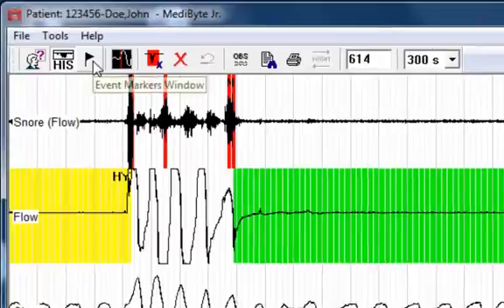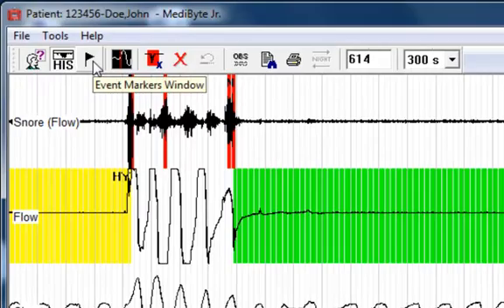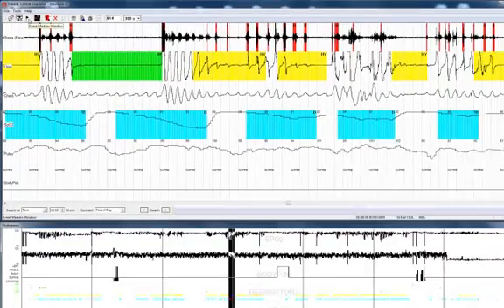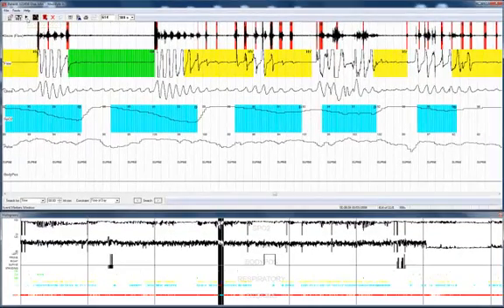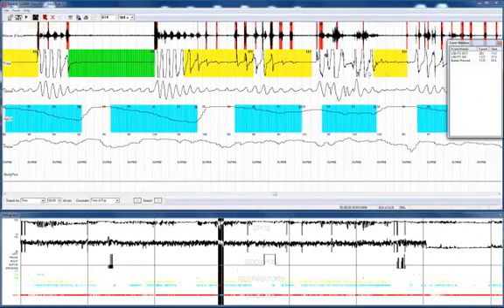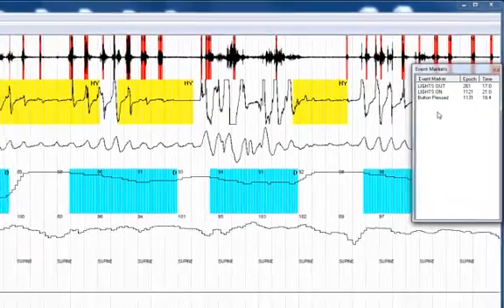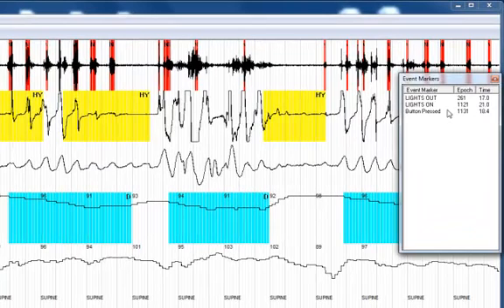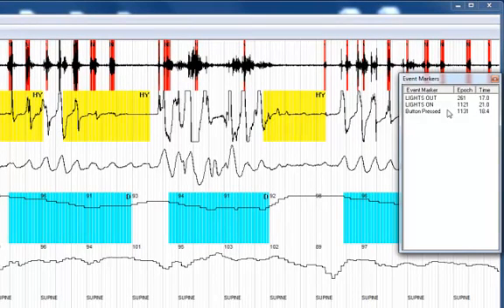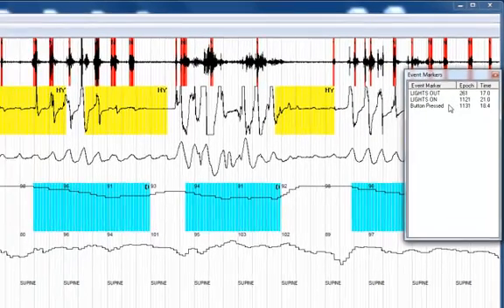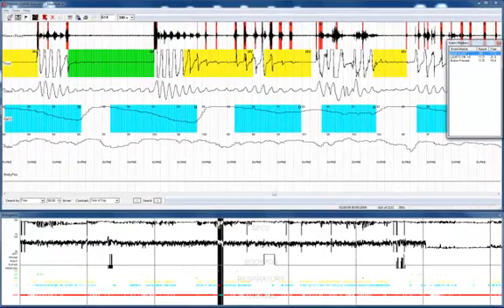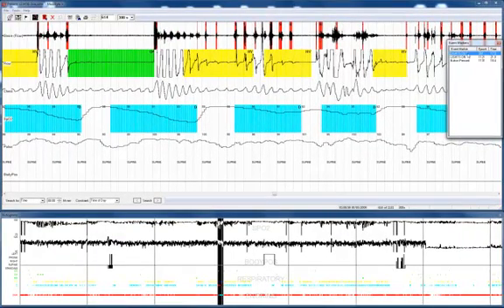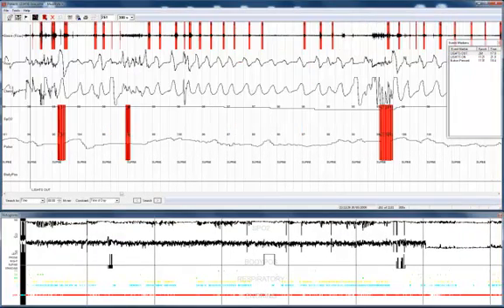The next toolbar icon we will discuss is the event markers window. Click this button and the event markers window will appear. It shows you a list of event markers that are in the recording including lights out, lights on, and if the patient pressed the event button during the recording. To jump to one of these event markers in the recording, select the event marker and double left click on it.